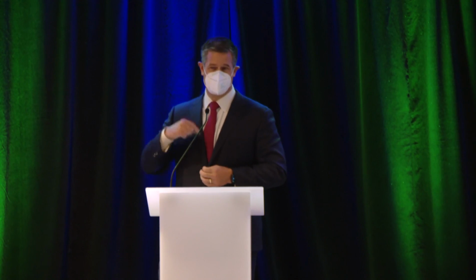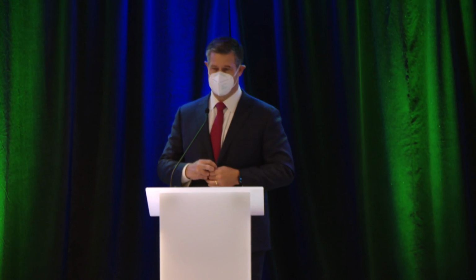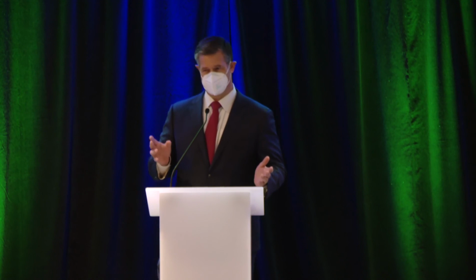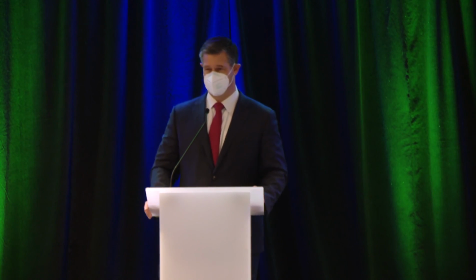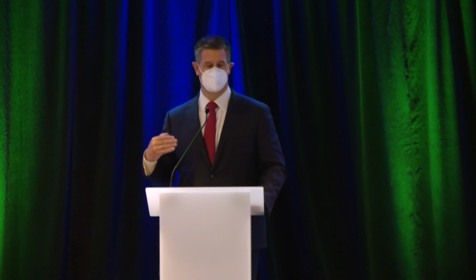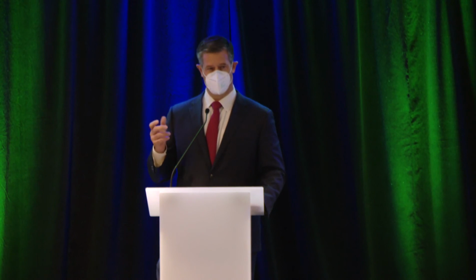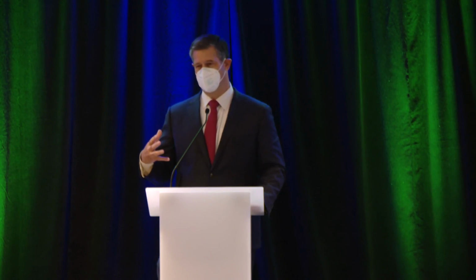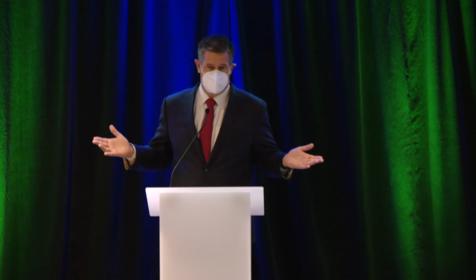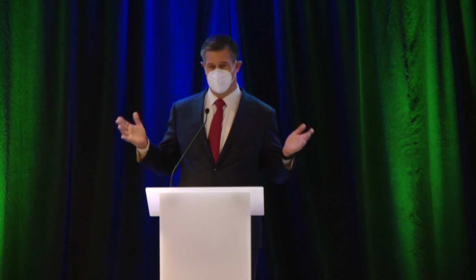One of the things that I think is important to do is to frequently have, if the nurse or technician has any question, and they have to have some experience, I think, to do this, absolutely do more than 10 swallows. And usually, in my lab, especially where I have a little more direct oversight, we're looking at at least 12 in every single study. You can read 12, and you can get percentages from that. And we do that all the time if they all look reasonable.